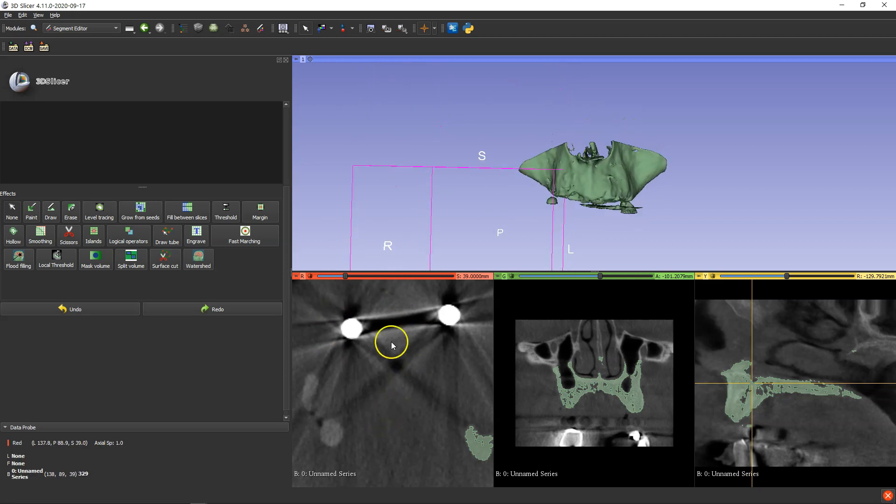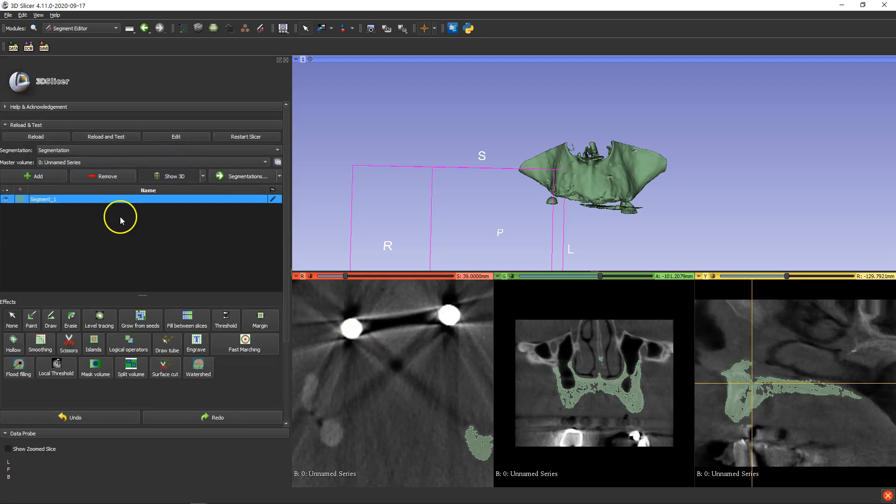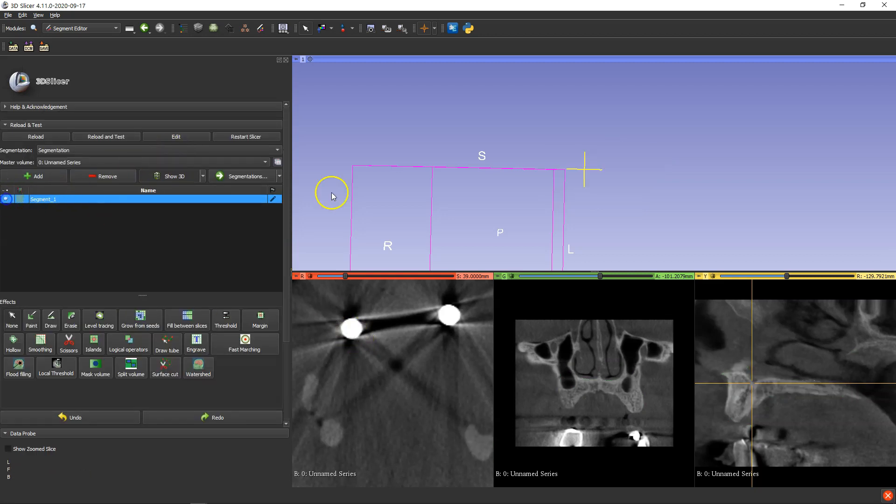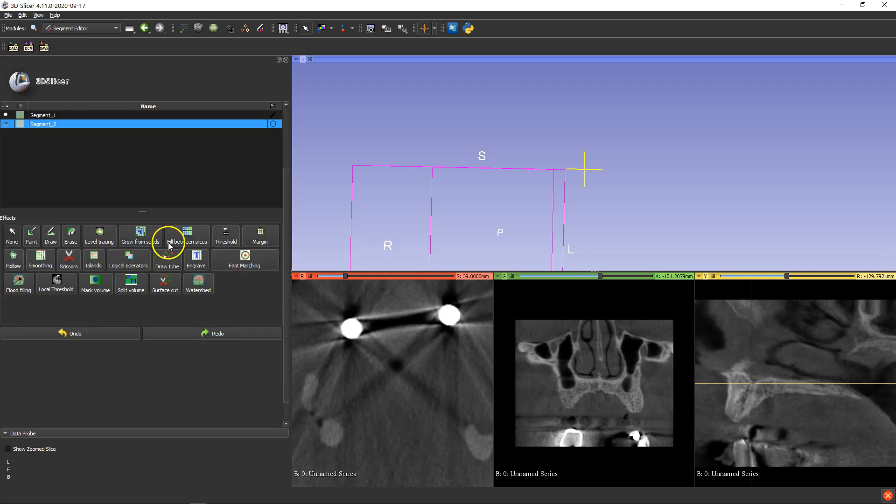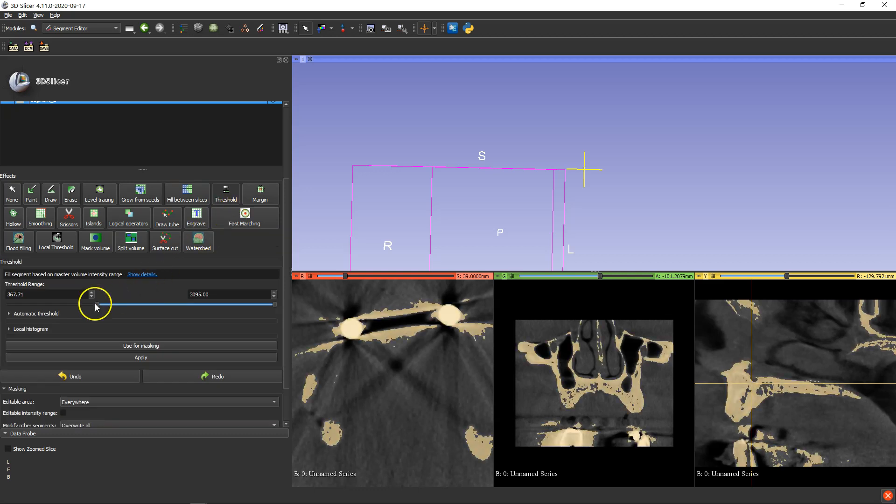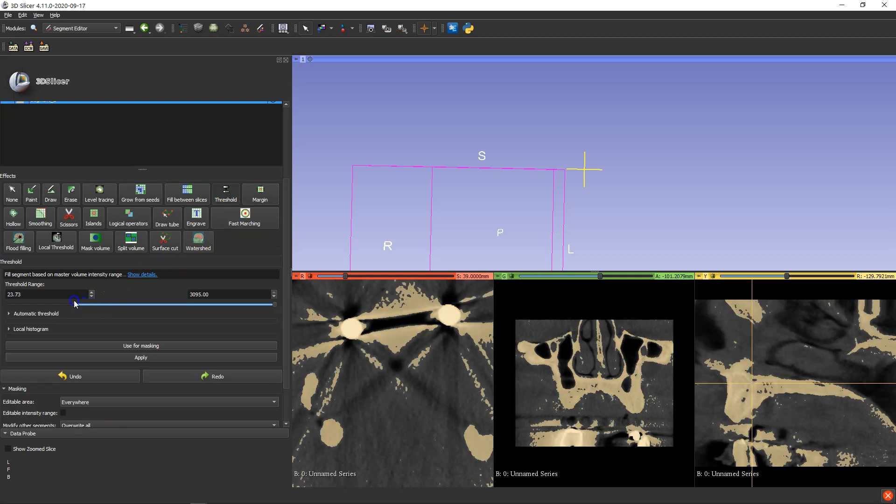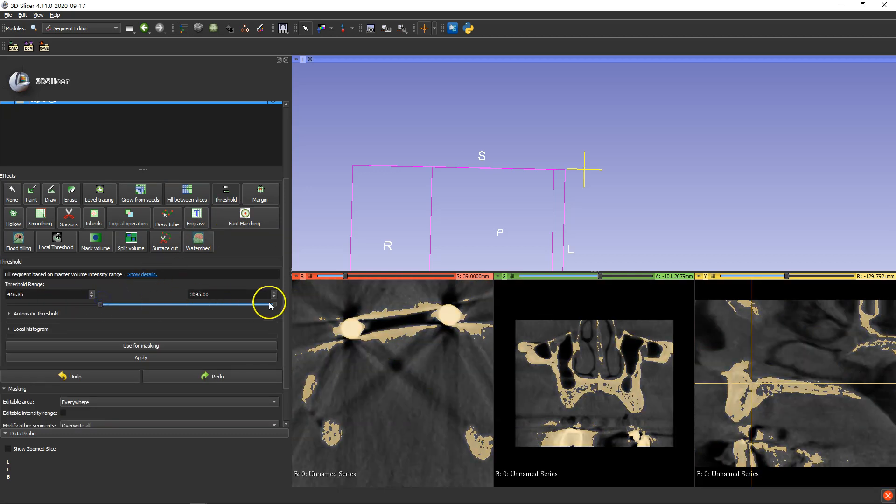How do we segment out these balls? Now that's quite easy. What I'm going to do is hide this maxilla segmentation, add a new segmentation, and we're going to go back to the threshold. But this time we're going to change the threshold that we can get these spheres.